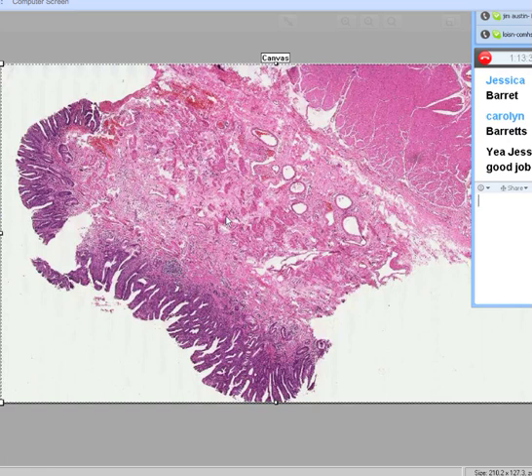So let me ask you this. If, let's say, 90% of the carcinomas of the esophagus, it's actually not 90, it's more like 75. If like 75% of the carcinomas of the esophagus were squamous cell carcinomas, if this part of the esophagus ever became malignant, would it be a squamous or would it be an adeno?